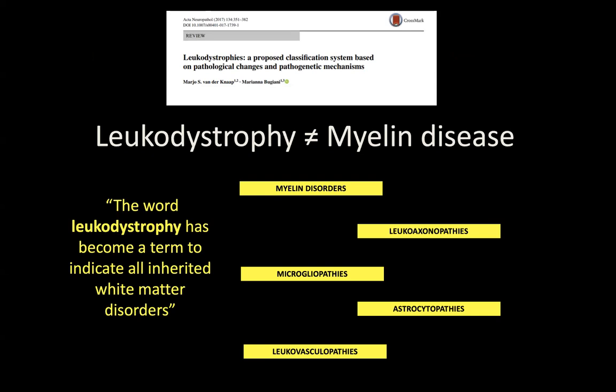If you look at the literature about the hypomyelination pattern as a radiological pattern, there are more abnormalities that are not purely myelin disorders pathologically, but can be, for instance, lysosomal disorders that also have a similar pattern. So what I want to teach you first is how to recognize a hypomyelination pattern and how to use this for your differential diagnosis.